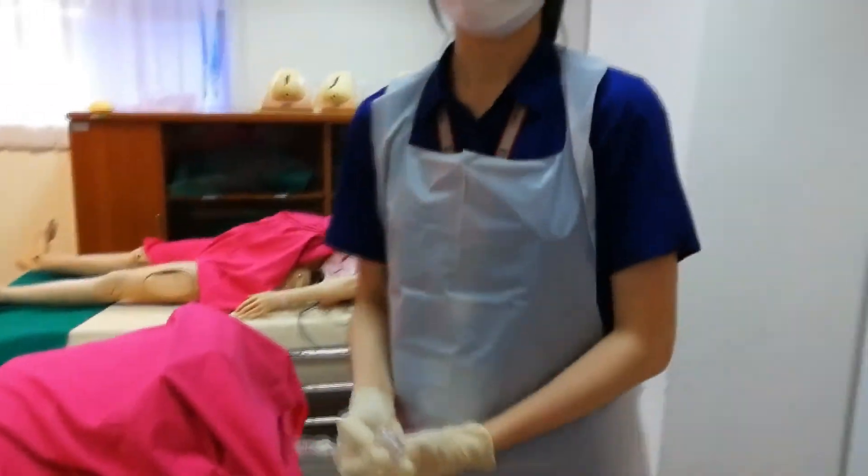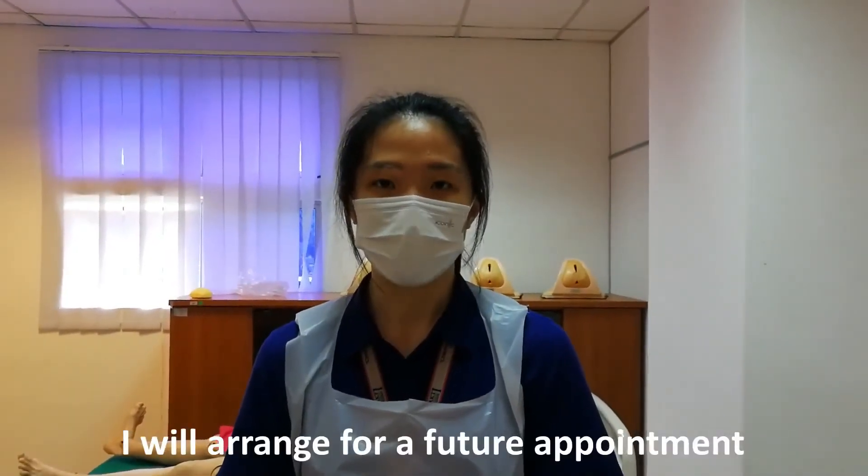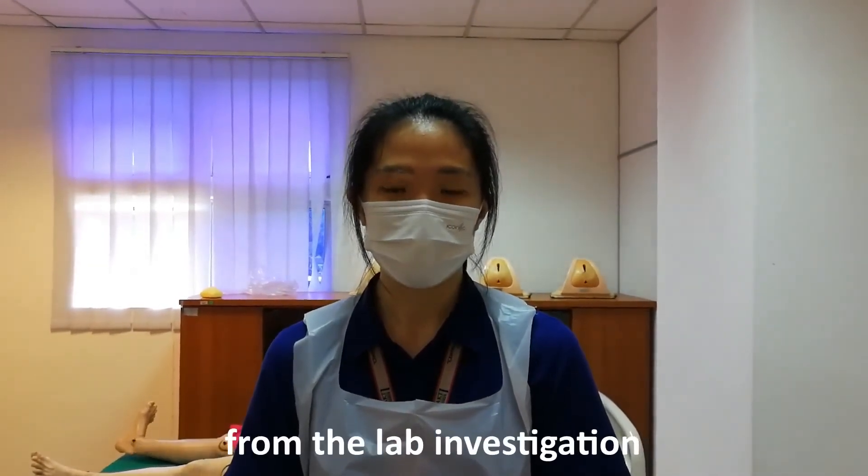Thank you, Madam! Dispose the speculum into the yellow bin. We will arrange for a future appointment to review the results of the histopathological examination from the lab investigation.